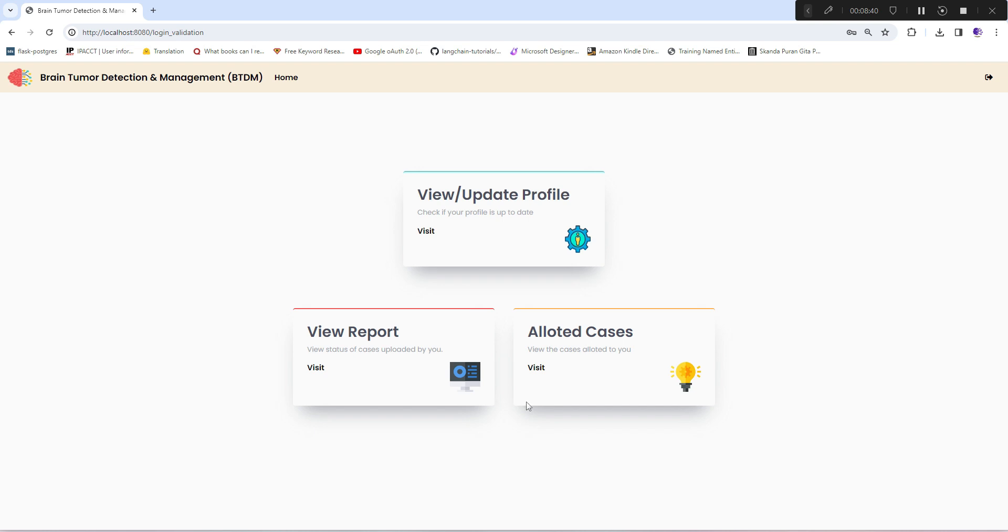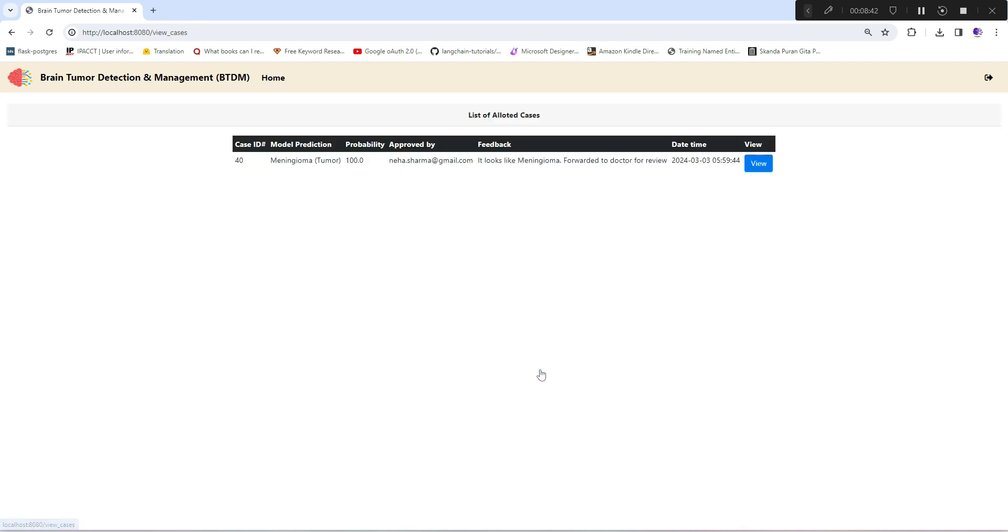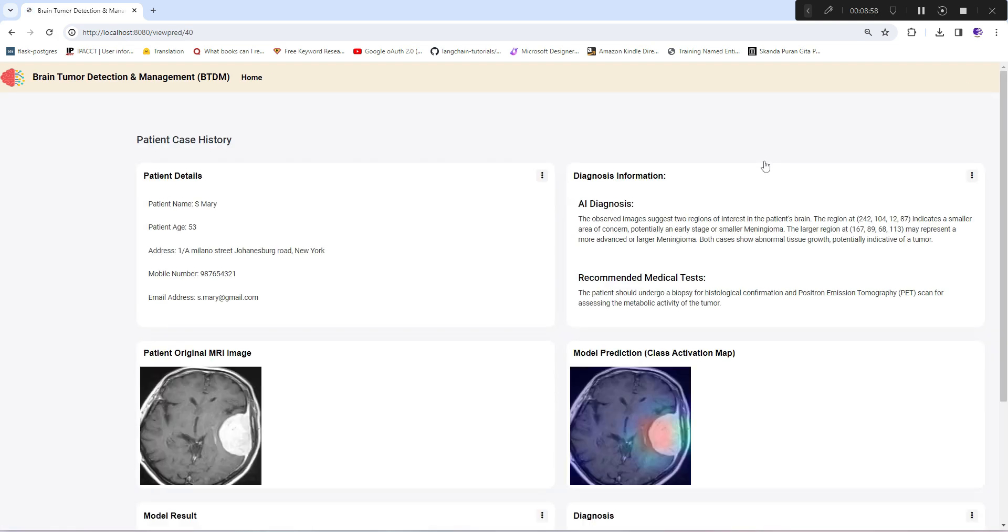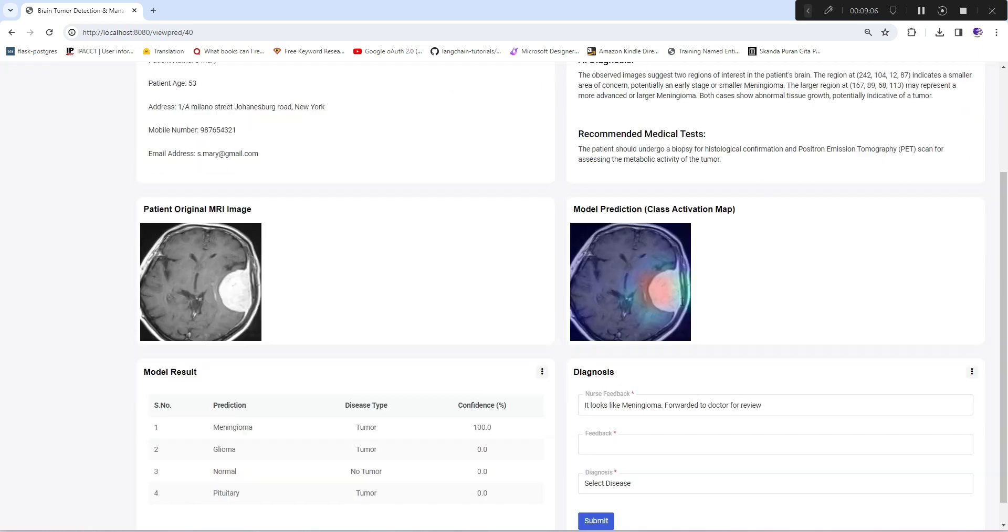These are the options which are somewhat similar to what the nurse gets: update profile, view report, and allotted cases. I'll quickly visit allotted cases. Here you see the case which is pending and needs to be handled by the doctor, showing generic information. Once he visits view, you can see the complete picture.